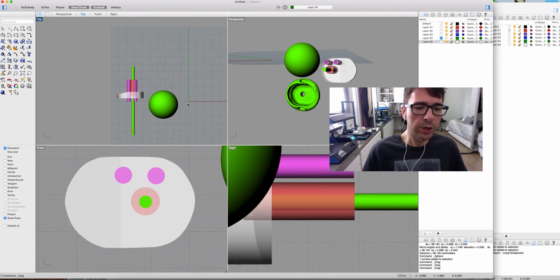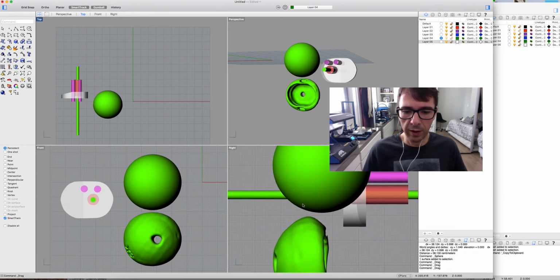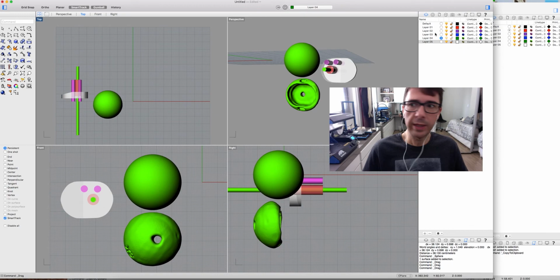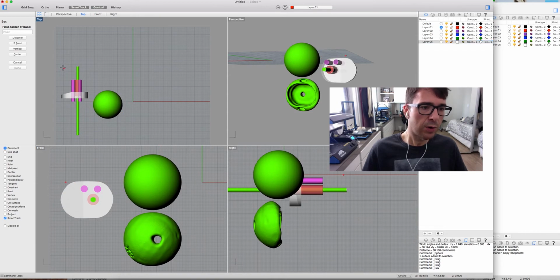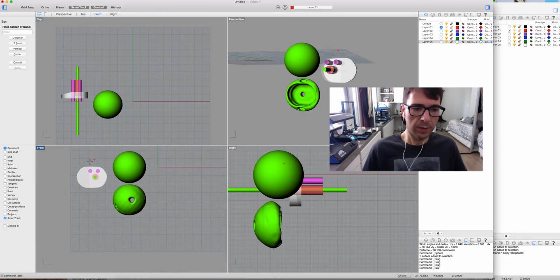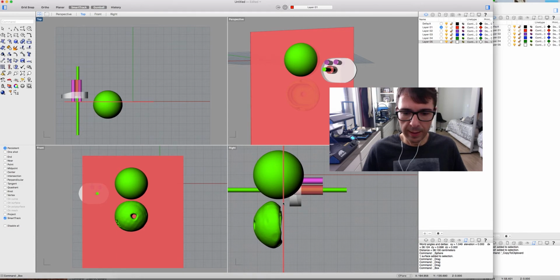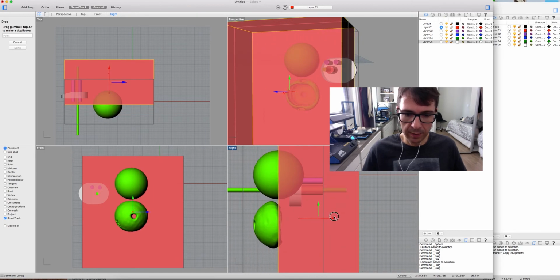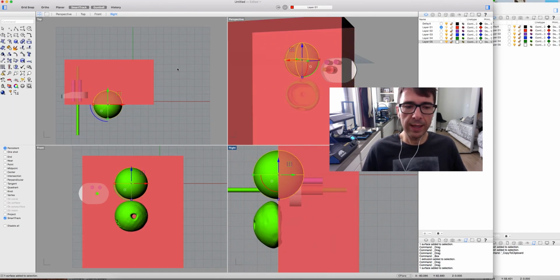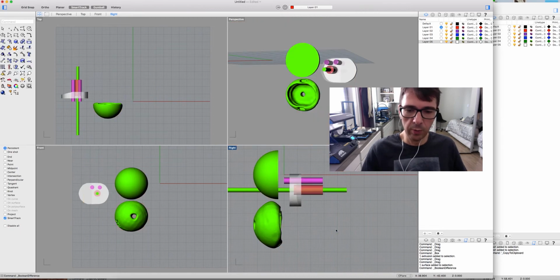Okay. And now we just have to cut in half this sphere, just as we did for the other part, just as we did for the base plate. Solid, a box. Let's draw a box over this plane here, and let's do just like that, and let's cut the sphere right there. So let's select the sphere, solid, Boolean difference, select the square, and now we have our sphere cut.